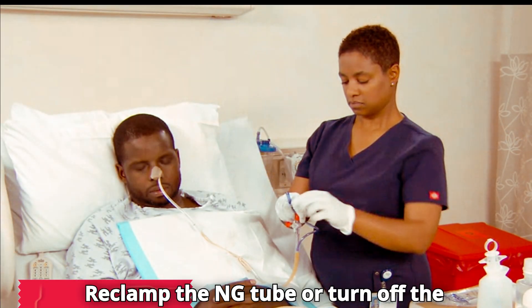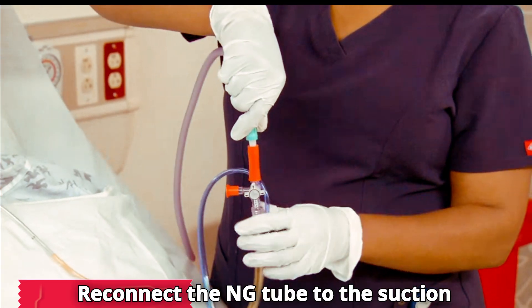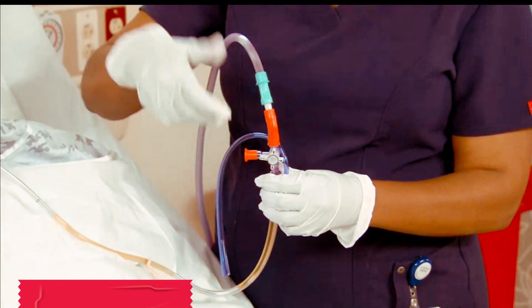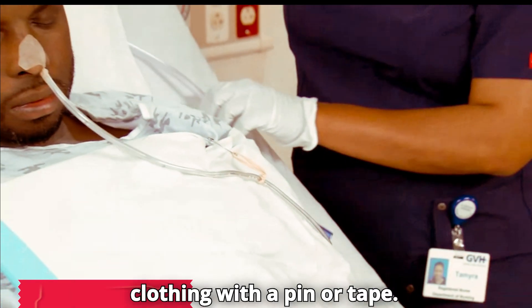Re-clamp the NG tube or turn off the stopcock. Reconnect the NG tube to the suction tube. Then release the clamp or turn on the stopcock.